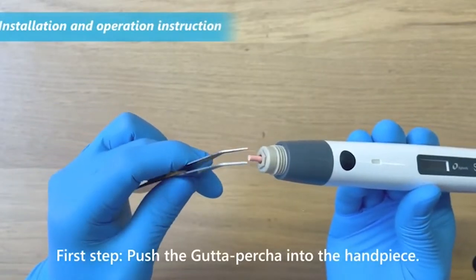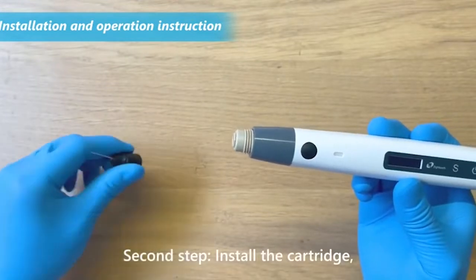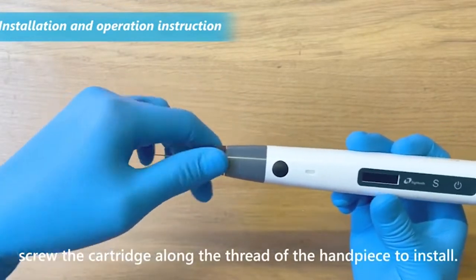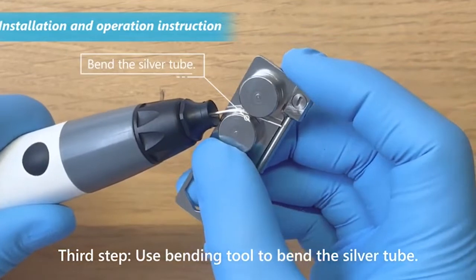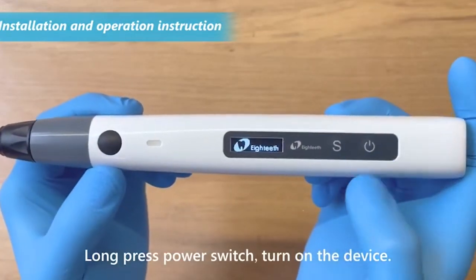First step: push the gutta percha into the handpiece. Second step: install the cartridge, screwing it along the thread of the handpiece. Third step: use the bending tool to bend the silver tube. Long press the power switch to turn on the device.